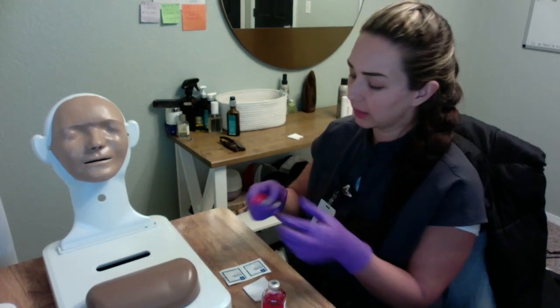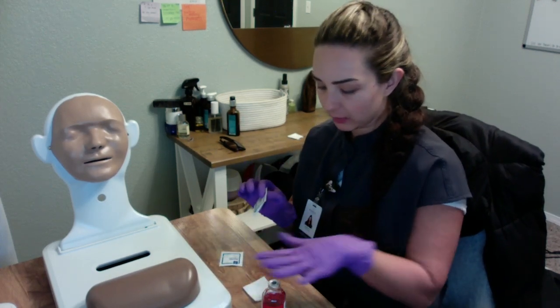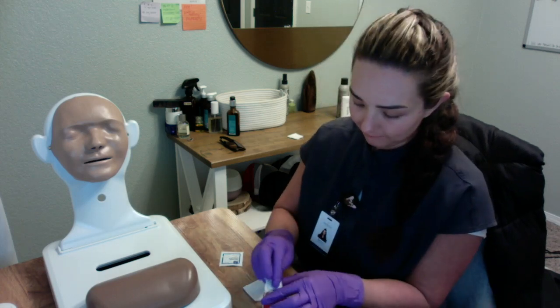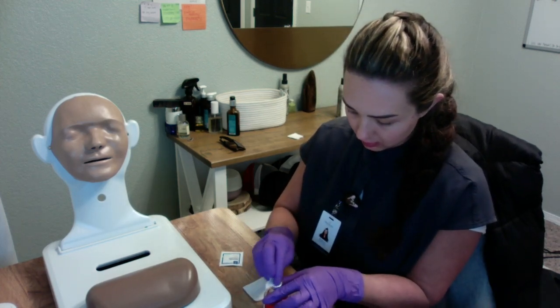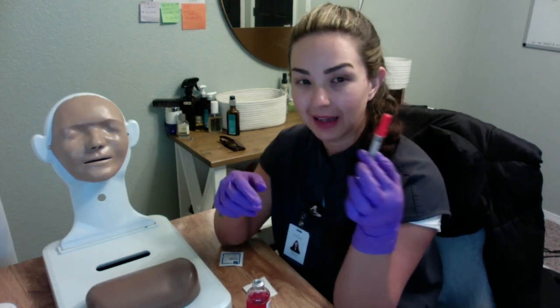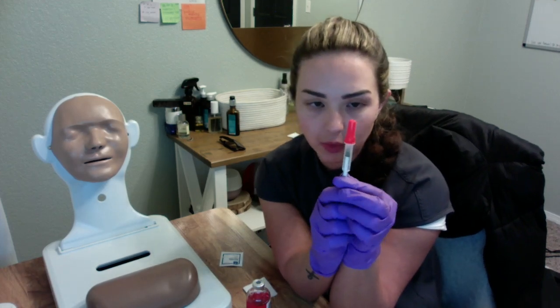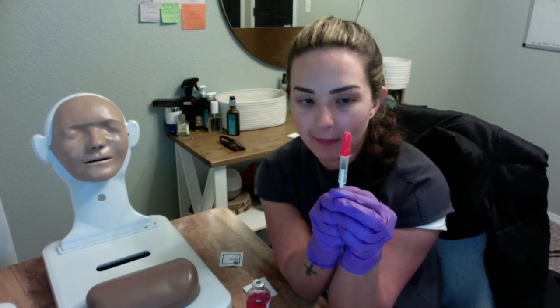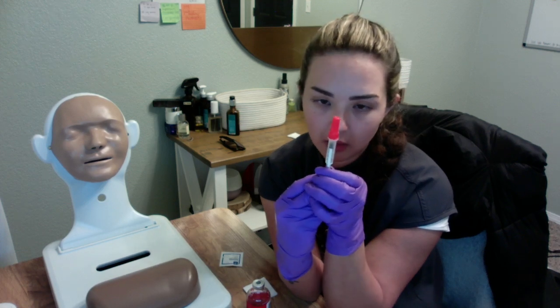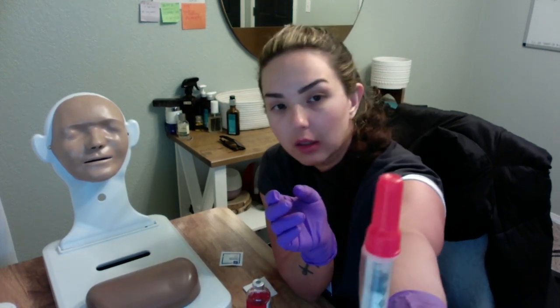Okay, so we're going to go ahead and get started. First things first, we're going to alcohol prep the top of the vial. Great. And then, first with the cap still on, we're going to draw up to the dose, and we're going to administer 0.1 ml of air into our medication vial.